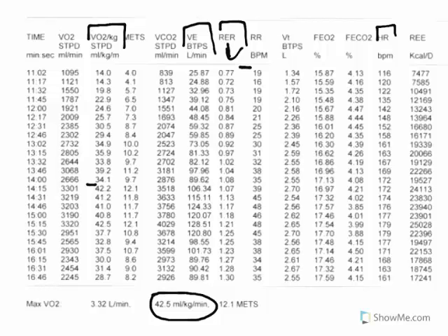0.70 is as low as you can go. That's 100% fat. 0.77 is pretty low. The majority of energy that he's expending is from fat. We see 11 minutes in, he's not working very hard, he's burning mostly fat. As you notice, time increases.